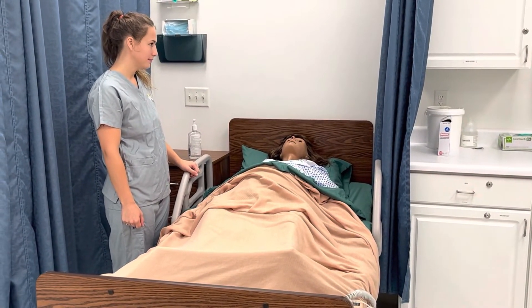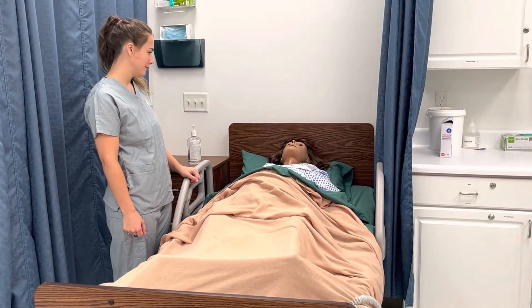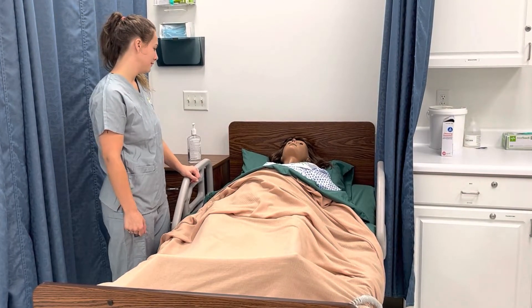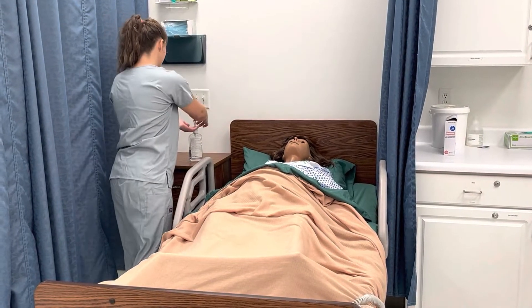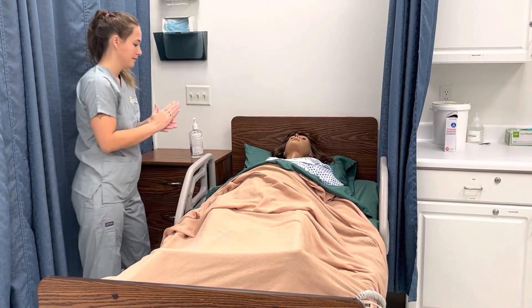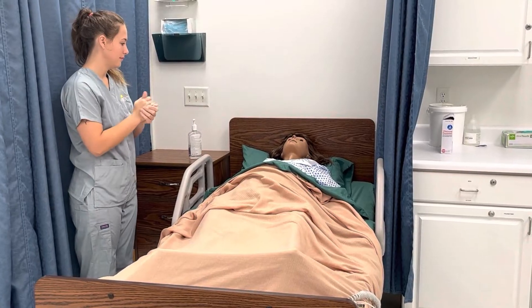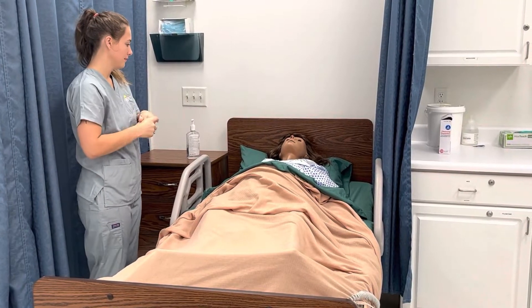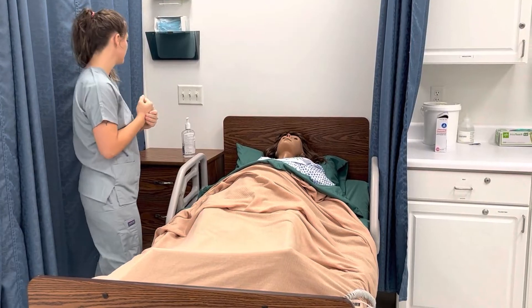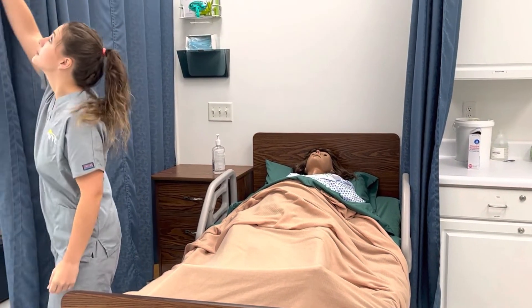When the nursing student walks into the room, the first thing they must do is ensure hand hygiene, so she's going to wash her hands. After she washes her hands, she's going to ensure that the patient does have adequate privacy.